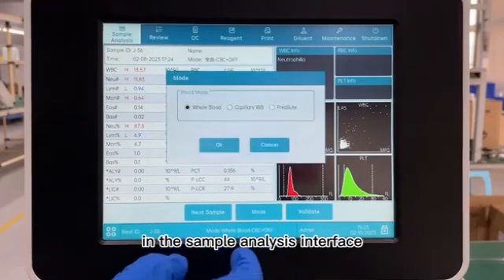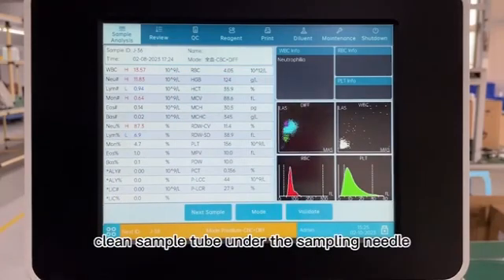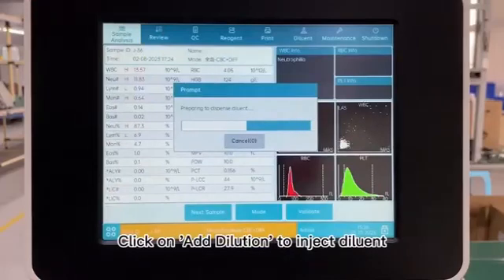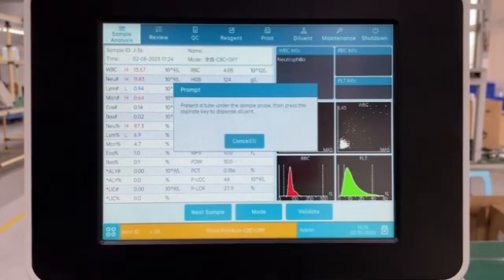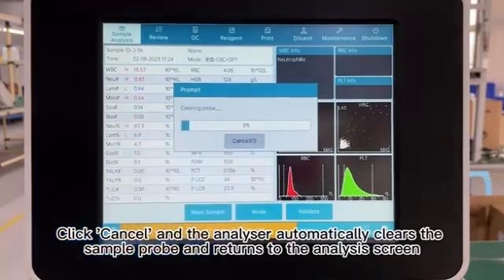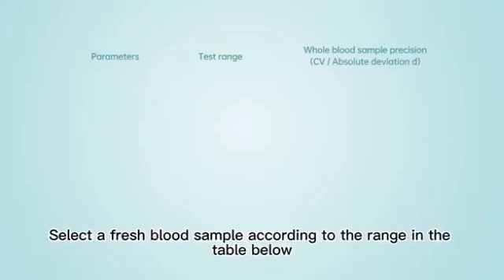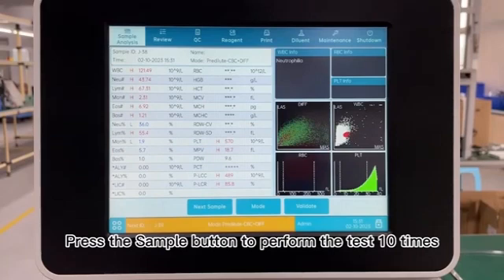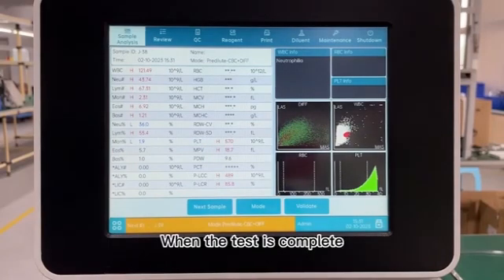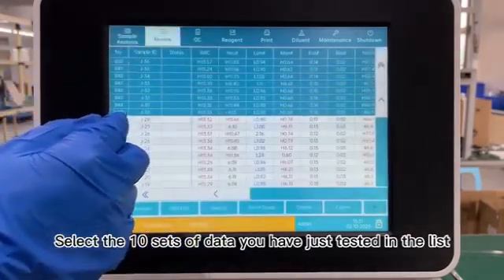29. In the sample analysis interface, select Pre-Dilution mode. Place an empty, clean sample tube under the sampling needle. Click on Add Dilution to inject diluent. Press the sampling button to inject a total of 1,800 µL of diluent. 30. Click Cancel and the analyzer automatically clears the sample probe and returns to the analysis screen. Select a fresh blood sample according to the range in the table below. 31. Add 200 µL of blood to the test tube and mix well with the diluent. Press the sample button to perform the test 10 times. When the test is complete, select the list to review. 32. Select the 10 sets of data you have just tested in the list. Click on Trend Graph to see if the repeatability is as required.